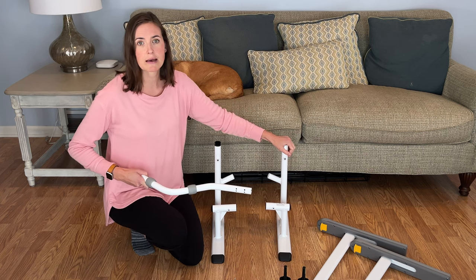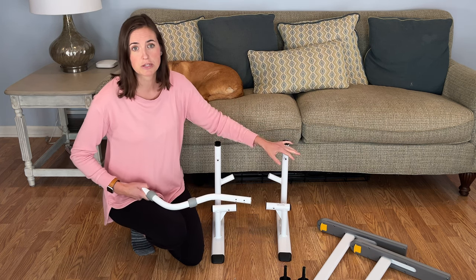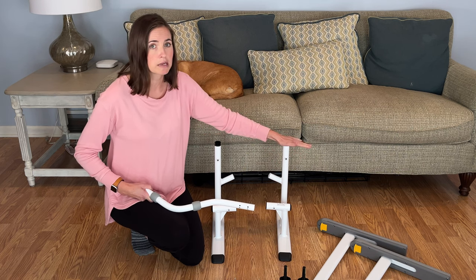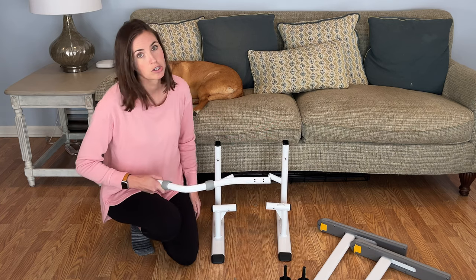You can also adjust the width based on the width of the person who's going to be using the frame. The frame's weight capacity is 320 pounds, so make sure that all works for you.